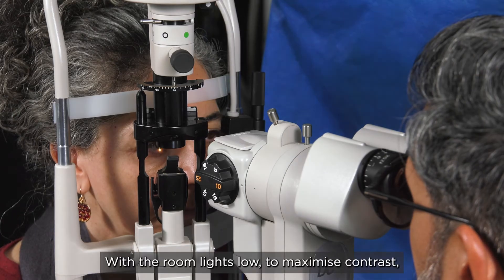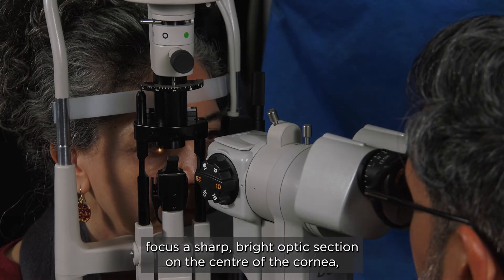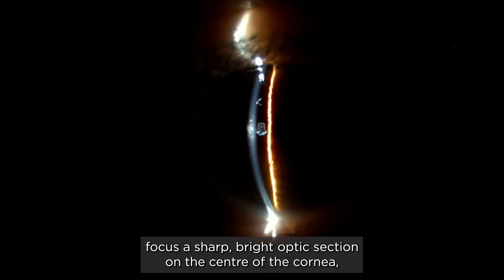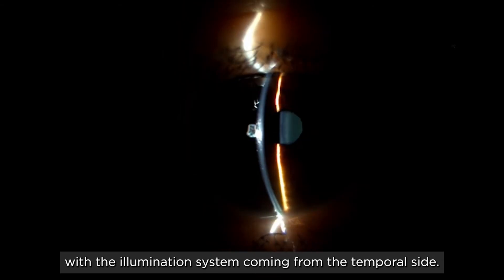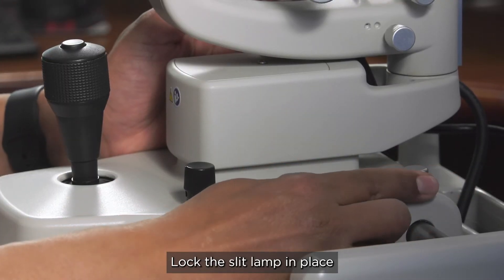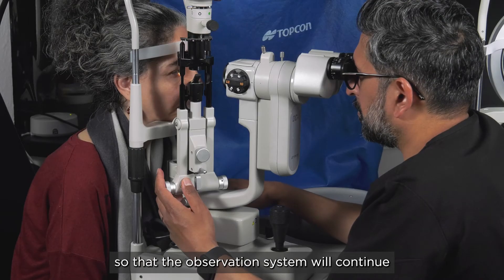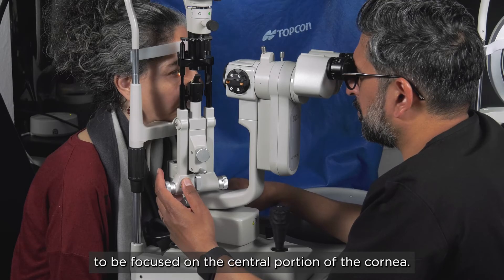With the room lights low to maximize contrast, focus a sharp bright optic section on the centre of the cornea with the illumination system coming from the temporal side. Lock the slit lamp in place so that the observation system will continue to be focused on the central portion of the cornea.